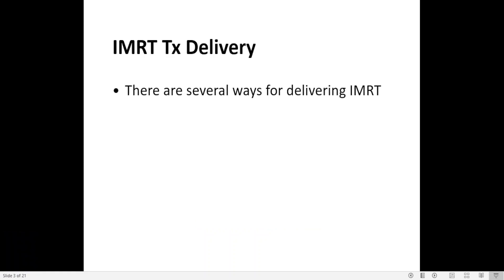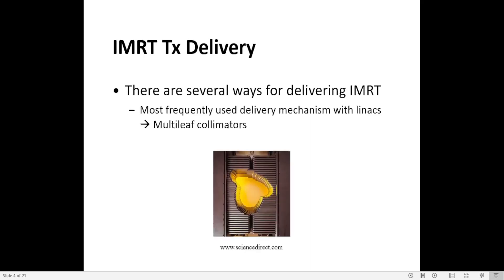There are several ways for delivering IMRT. We have conventional IMRT with MLCs, rotational IMRT — examples are tomotherapy and VMAT — with MLCs and compensators. In this presentation I'm going to focus on ways to deliver IMRT with MLCs, because they are the most frequently used delivery mechanism with LINAC.